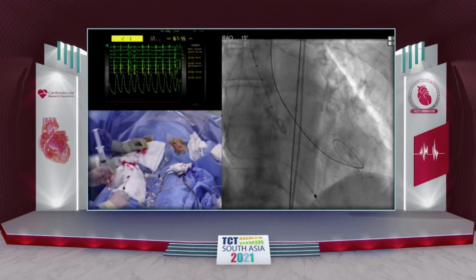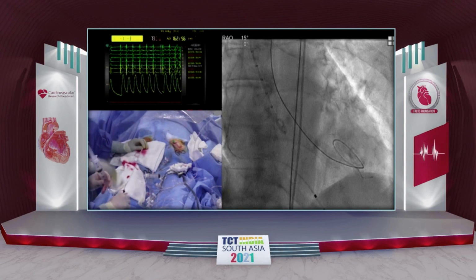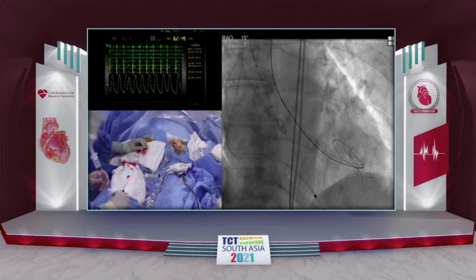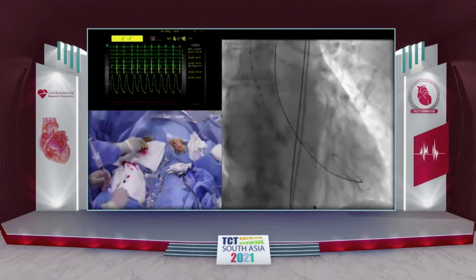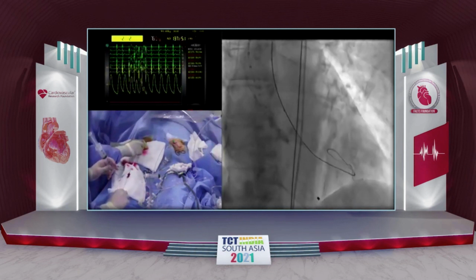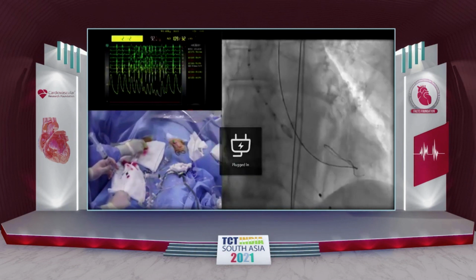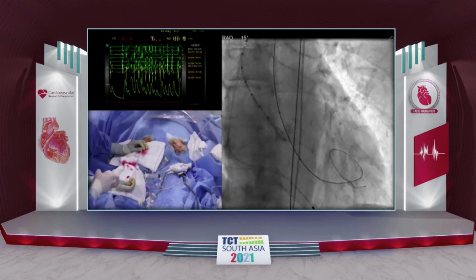One of the advantages of doing things under local is that the patient gives excellent feedback to us if something is not going well. The other disadvantage, obviously, is that you have to be fully aware and ensure the patient is fully awake and conscious, so you do need to keep them fully informed. You can't depend everything on your anesthetist to do the job. That's a very important point, sir. Actually, Kribir was also mentioning this. When you push something, if the patient gets into pain, you avoid applying too much force and you avoid complications too.